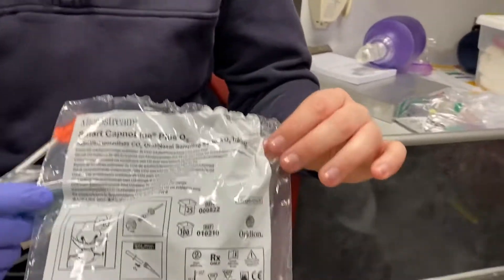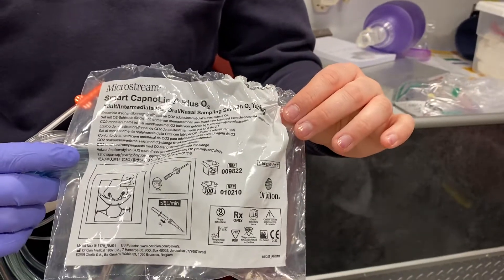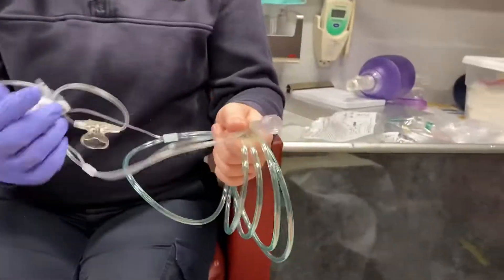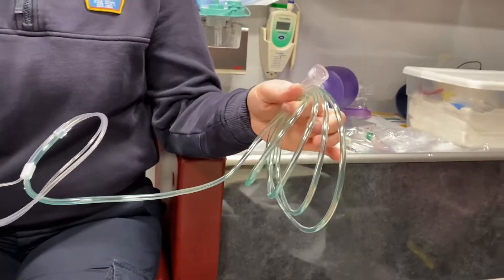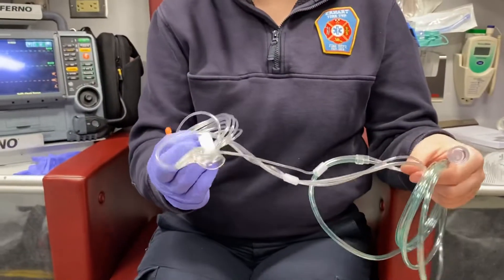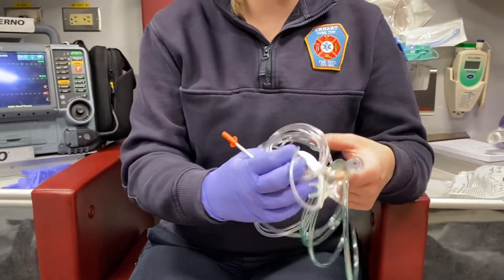Most of the new nasal cannulas come with waveform capnography on them already. When I take it out, you'll see that there are two hoses here. The green hose is what plugs into your oxygen — oxygen is always going to be green — and this is the cannula part that goes on your patient.